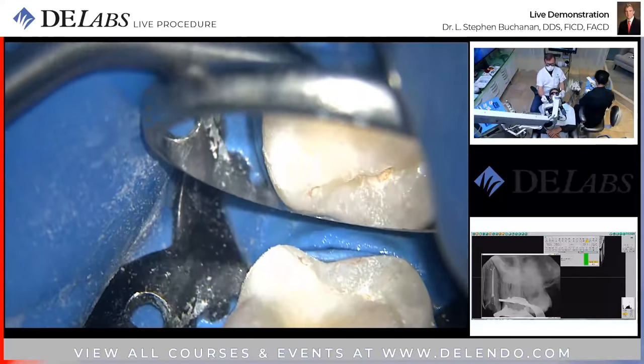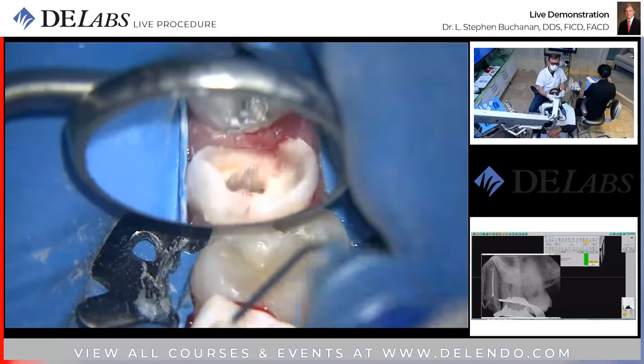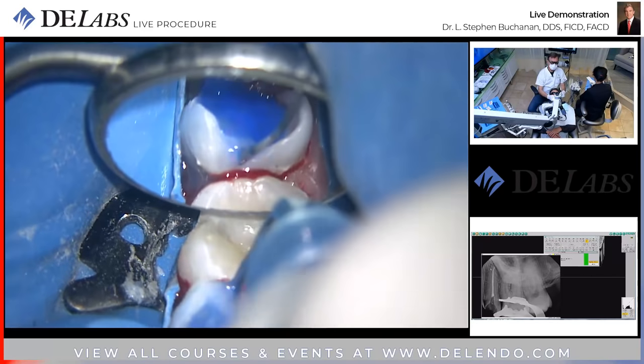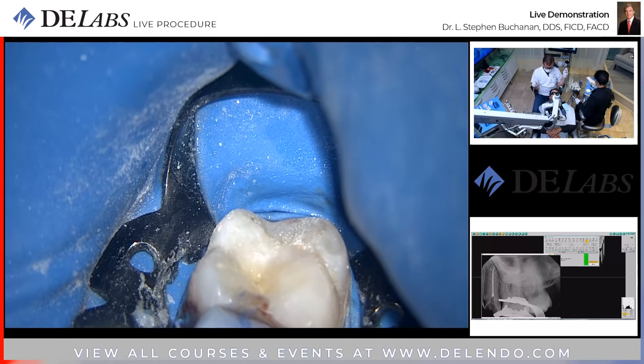Just talking to my good friend Daniel Cherney, my guru for all bonding questions and answers. He liked the fact that I was using air abrasion, but he said you still want to do a 20-second etch and a 30-second wash.